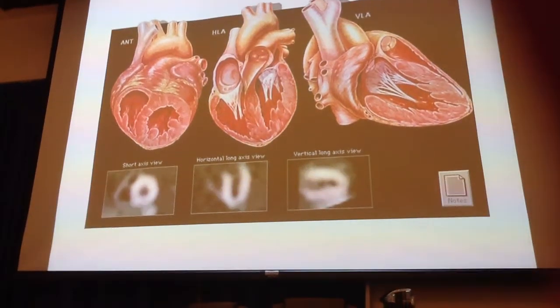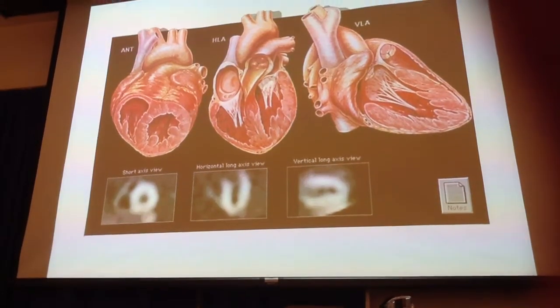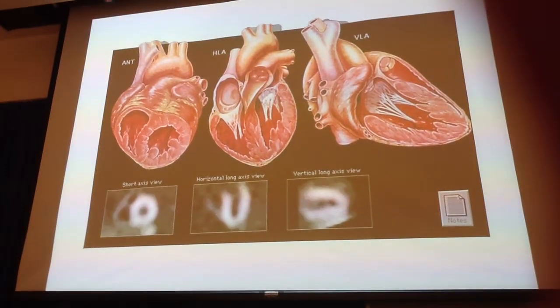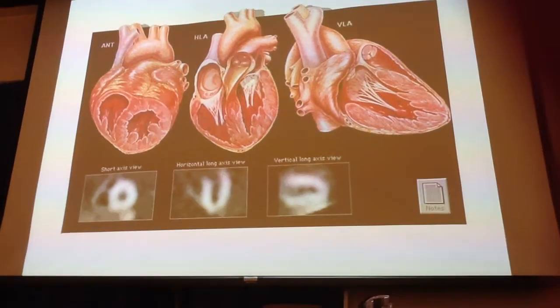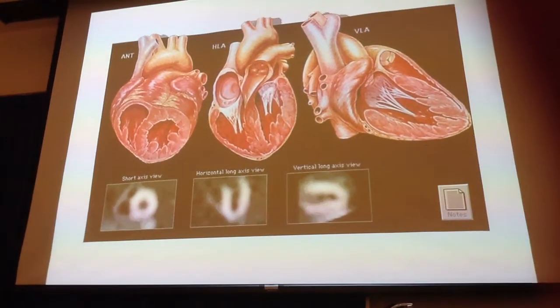And we're doing SPECT imaging, this is what we're looking at. Okay? So all of these would look the same. But again, depending upon which agent you're using, that's going to determine what it is that you're seeing. Now, if we're looking at perfusion, does perfusion necessarily tell me if the myocardium is in good condition or if it's still alive?